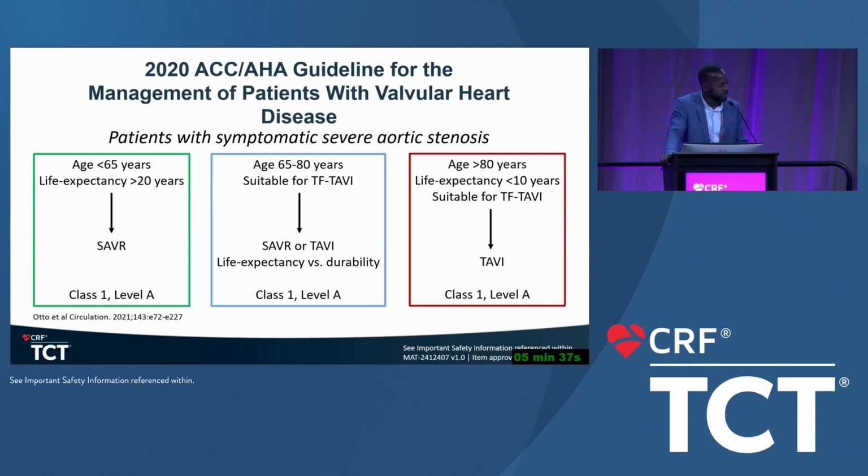What's your view? I think surgical technology is very different because the posts are much wider and thicker. And I agree with Azeem that we haven't had to think about it in intraannular nearly as much. And also Bassem, I agree with that. If we stick with any intraannular leaflets like we have with this valve, I don't think it's much of a consequence if you have full alignment. Quite honestly, I think that's helpful, but it's not mandatory.